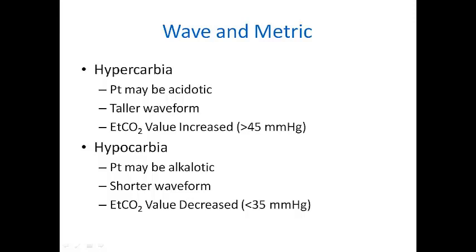Hypercarbia is going to show on a normal waveform pattern as a taller waveform as our value of end-tidal CO2 has grown over 45 millimeters of mercury. Since we have more gas present that is associated with acids within the blood, our patient might be acidotic at this point.